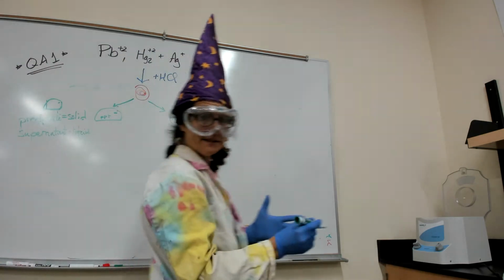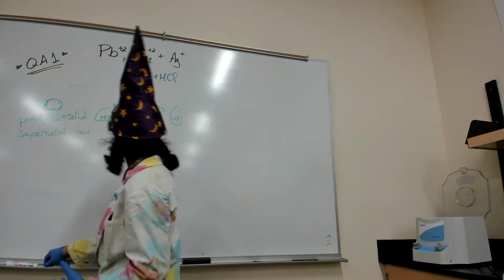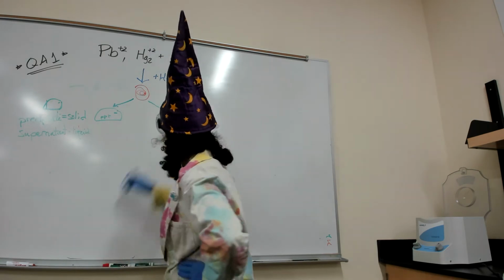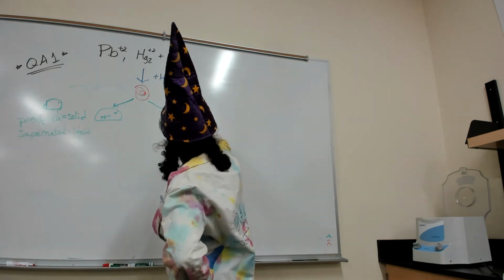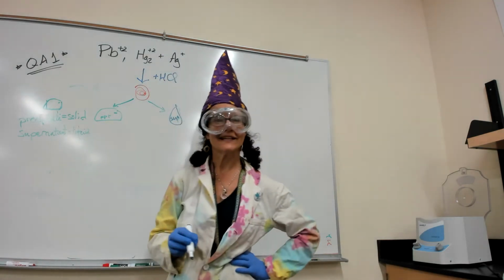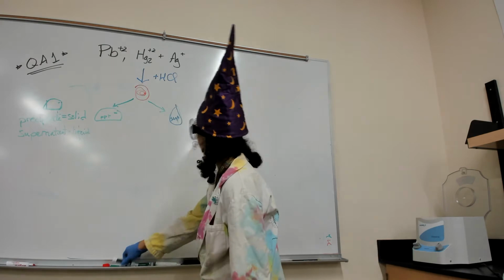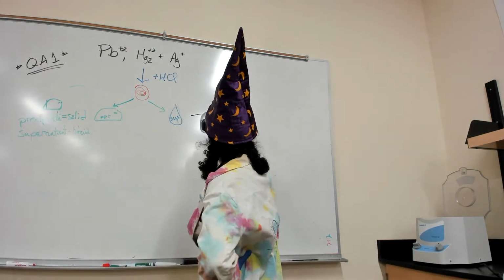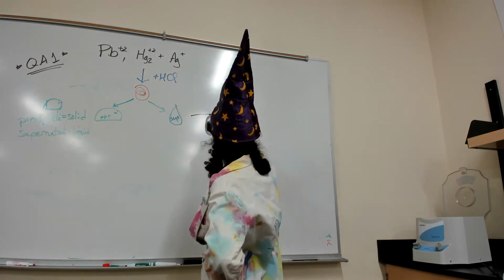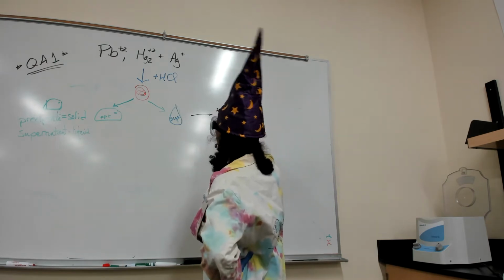The supernatant, we're going to do nothing with. And you know what? I just realized I used green, and you guys don't like green. Let's try the supernatant with blue. So that's our SUP for short. Probably also not showing up. This is going to go in the garbage. This would go to be tested for group 3 and group 2.